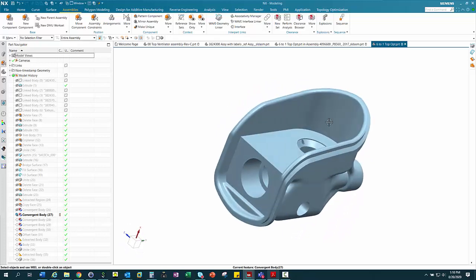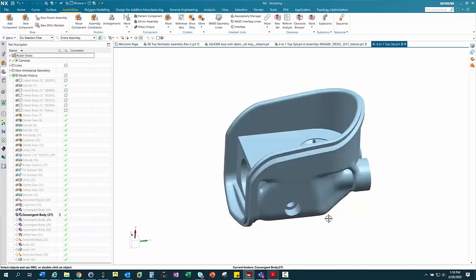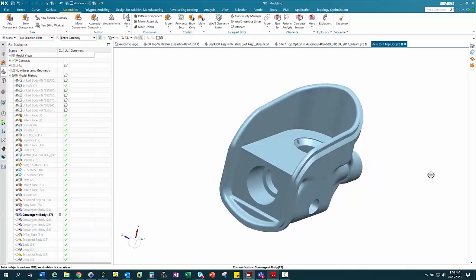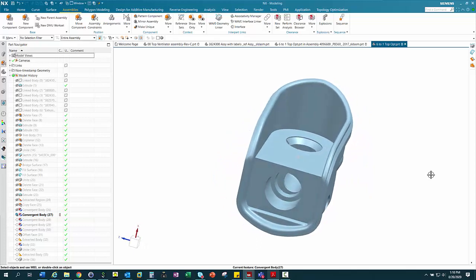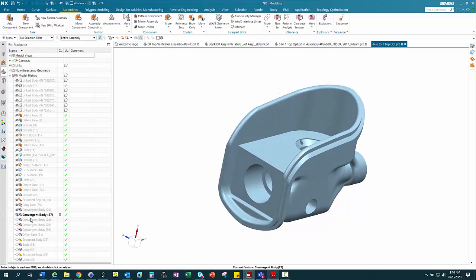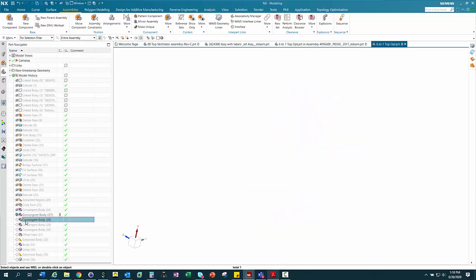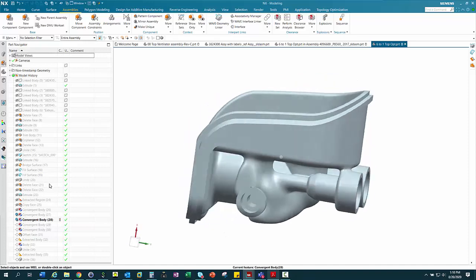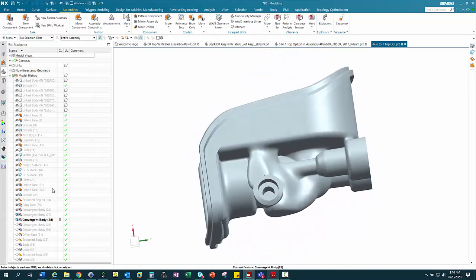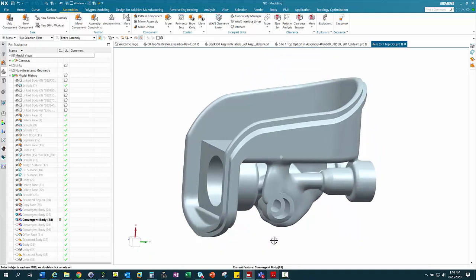Now this doesn't have the open inside like the other one. It is pretty beefy though. Possibly we could reduce mass. We really don't care about weight for this, but in many additive manufacturing scenarios, weight is super important. So we could run it again, and we could get many, many different scenarios. So this one's more lean. This is actually pretty nice. This, to me, is what we're looking for.